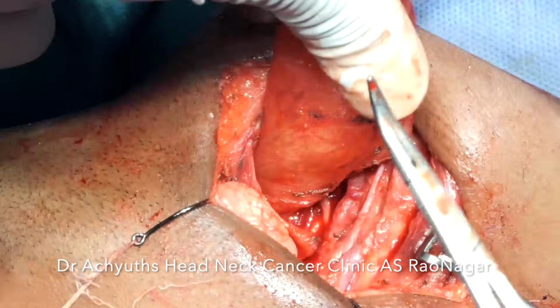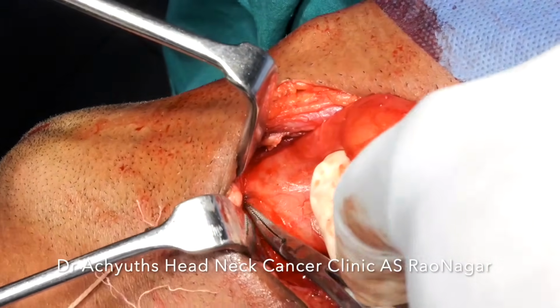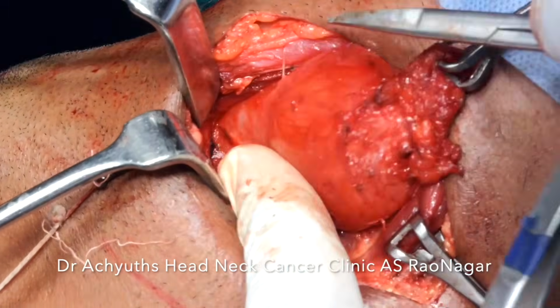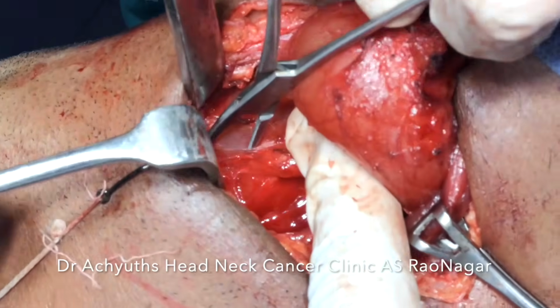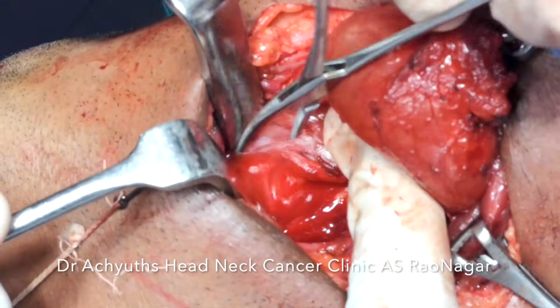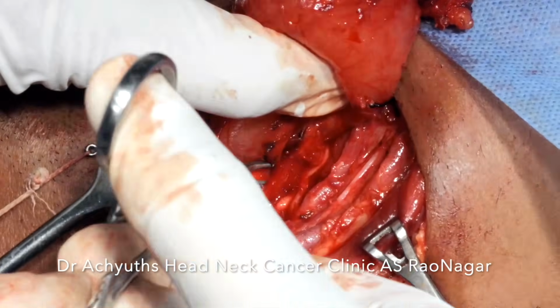Here it is better we divide the attachments as close to the cyst as possible, so that more muscle is preserved, and that gives us more freedom in reconstructing the pharyngeal wall and the laryngeal framework after the excision is done. So we want more normal structures to be preserved.